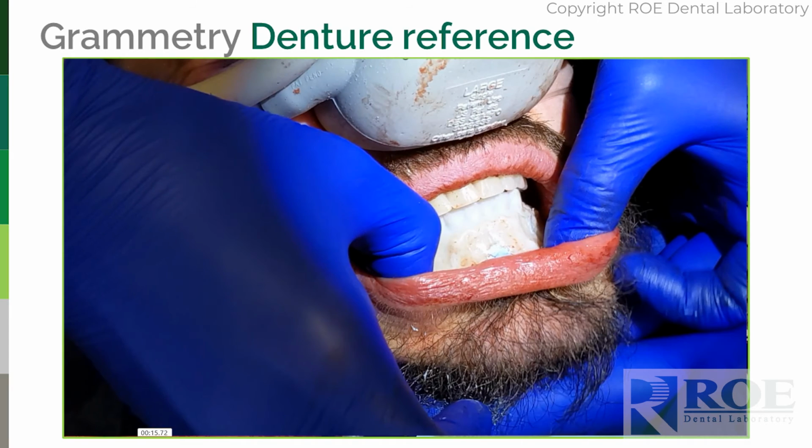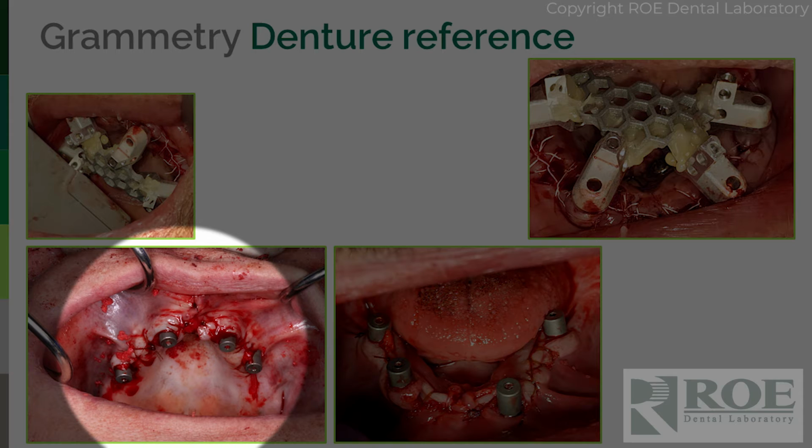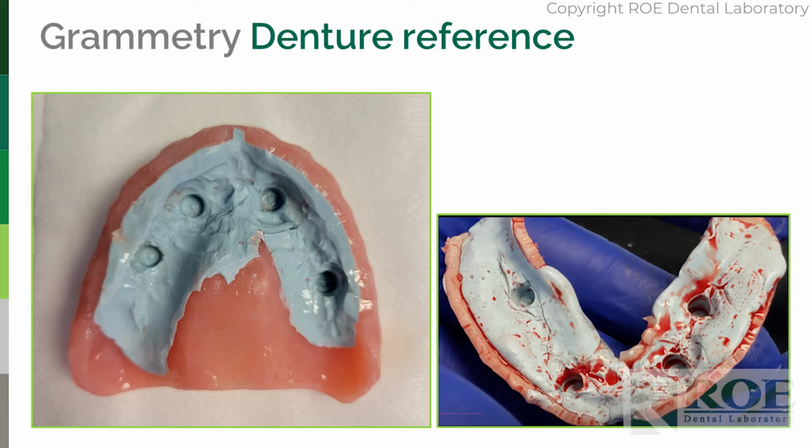Now here's the trick. This is very important. You want to try that denture in, those dentures in, prior to loading them with impression material. These dentures cannot rest on top of those healing collars. Okay, these healing collars are kind of tall. They're very tall. So you probably want to use a lower profile healing collar for this process. Okay, but you do not want any burn through of the healing collars. These must be entirely in wash material. Otherwise the denture is tipping on one or more of the healing collars and you're not getting the proper bite. So do a wash impression.